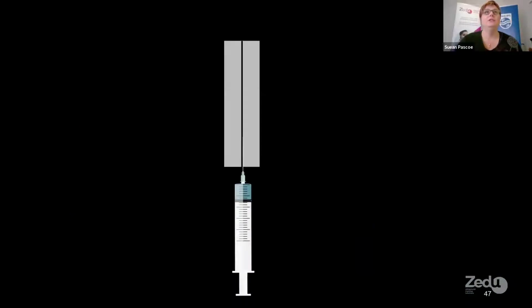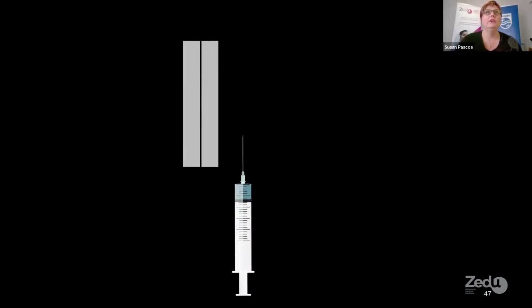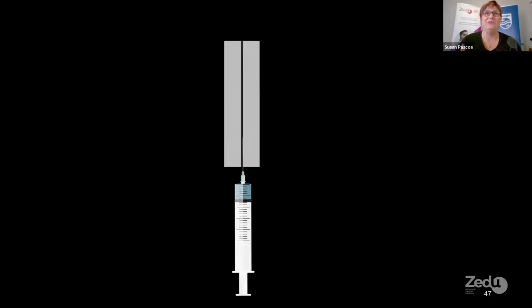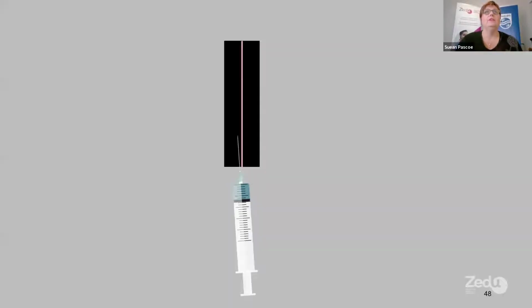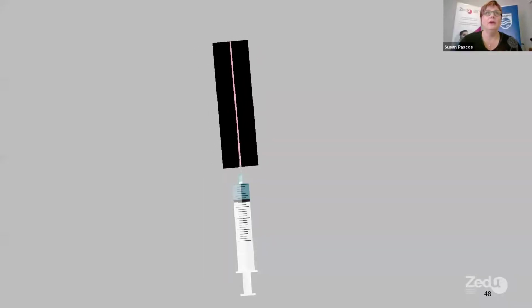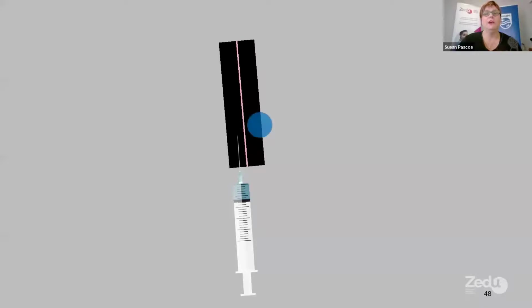This is another way to demonstrate. Once you've got your needle in place, if you can't see the needle in the longitudinal plane, slide left and right. If you've lined up straight, sliding left and right should find your needle plane. And if you're a little bit off, you either rotate and then slide. But the problem occurs when your anatomy is sitting over here.